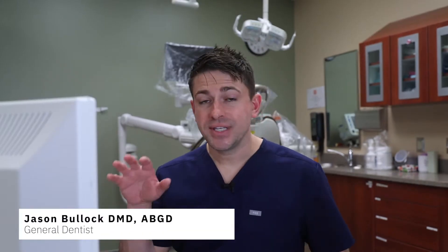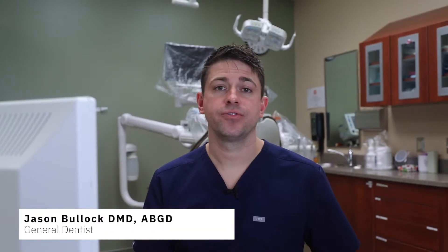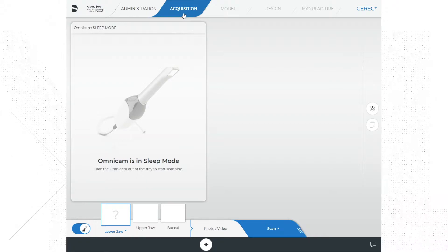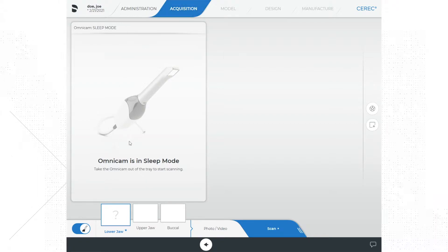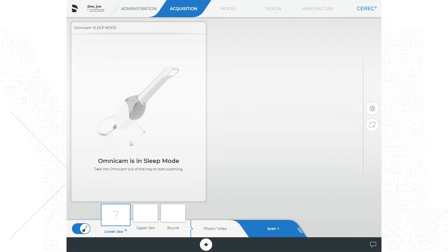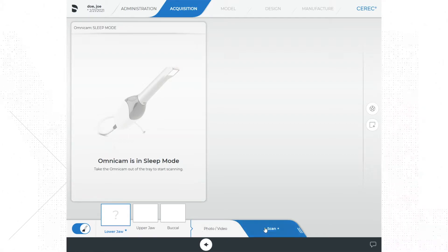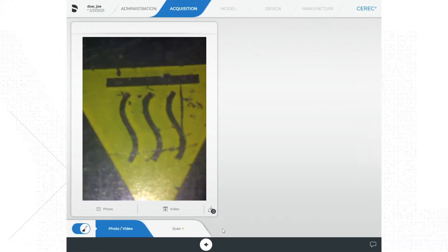We have transitioned to the acquisition phase, as indicated by the phase bar at the top of the screen. On this screen there are a few things to note. On the far left is the camera view, and when the camera is being used this is where you will see what the camera sees. Below the camera view is our step bar, which gives us the option to scan, shoot a video, or take a picture with the camera.